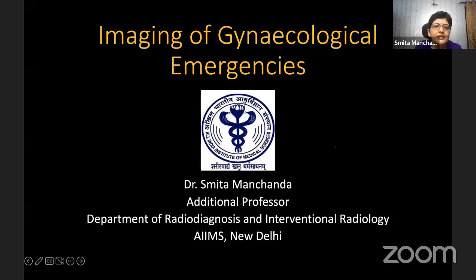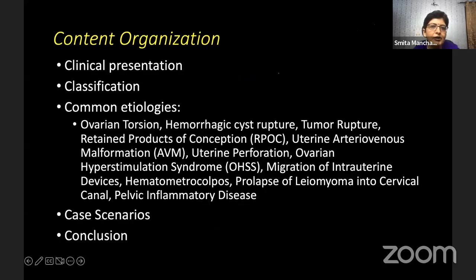Okay, so basically I'll be covering imaging of gynecological emergencies today. This is how I've organized my content: the clinical presentation, the classification, the common etiologies, whether they are related to the uterus or the adnexa, certain case scenarios, which we will try and make interactive, and then the conclusion.